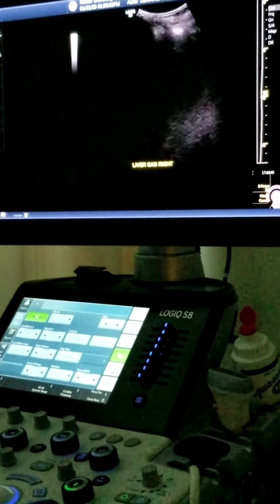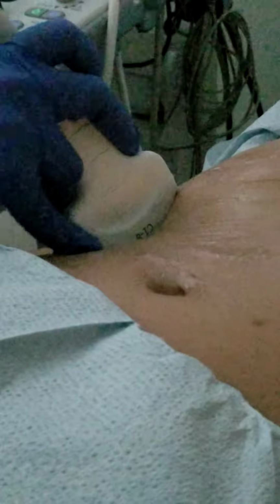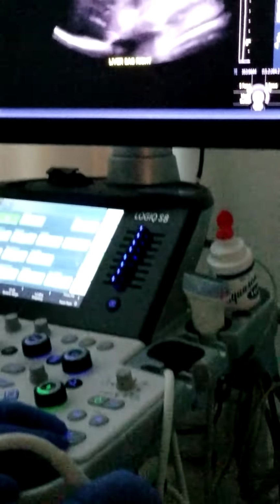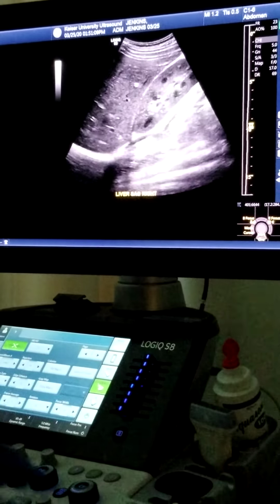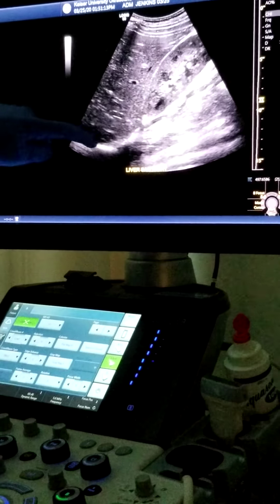And then I'm going to measure the liver. So what I was doing was I started at xiphoid, and I started coming down this way for all my sagittal pictures. But when I go to my measurement, I'm going to straighten out my probe so I'm more sagittal. Take another breath in when you're ready. So in this view, now you can see the tip and the dome.